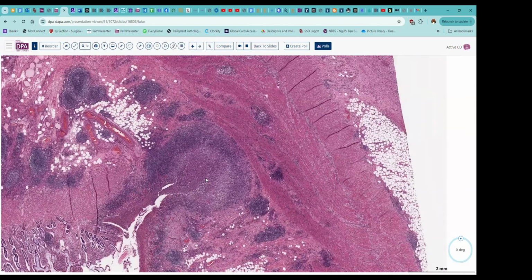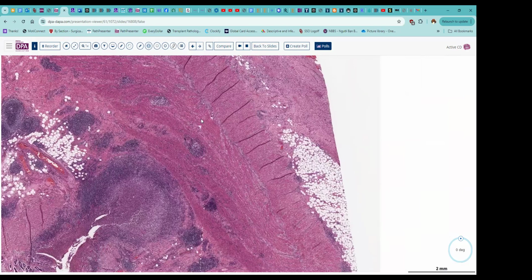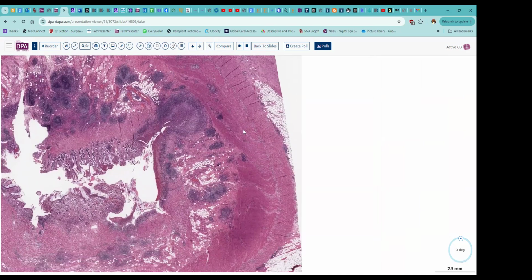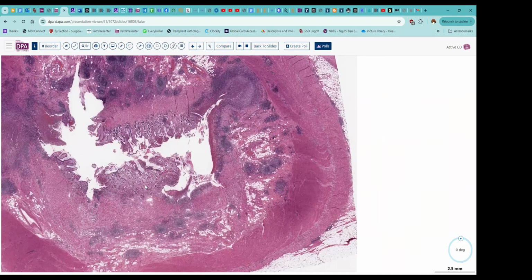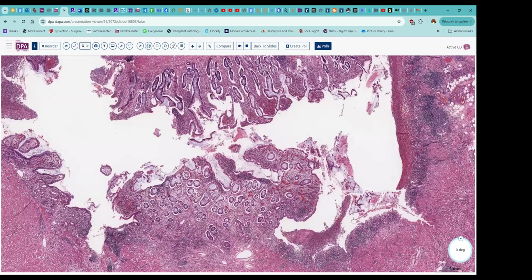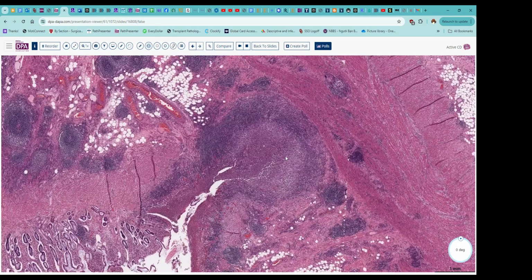And of course, this is the predisposing feature that tends to make Crohn's disease more likely to form fistulae. Fistulae are decidedly rare with ulcerative colitis, not impossible, but much more uncommon. So two nice features of Crohn's disease here: the pseudopolyp, a relatively spared mucosa with ulceration on each side, and the nice fissuring ulceration that could predispose to developing a fistula.